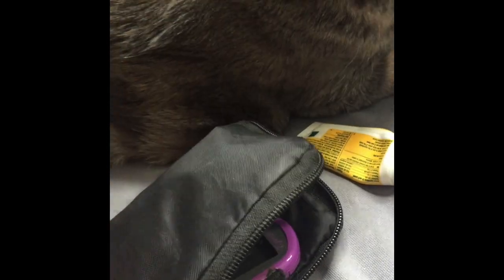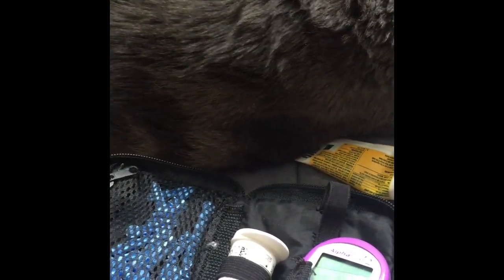So I use an AlphaTrac meter, which is a pet meter. A lot of people use human meters and that's fine too. Human meters run a little bit differently — they run a little lower than pet meters. But either one will tell you if your cat's higher or low.